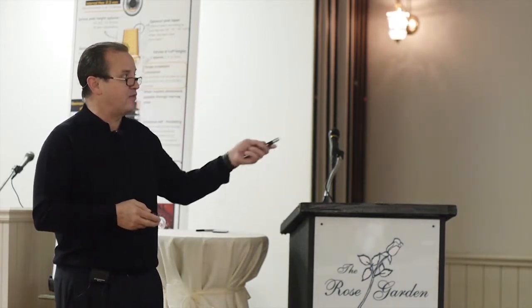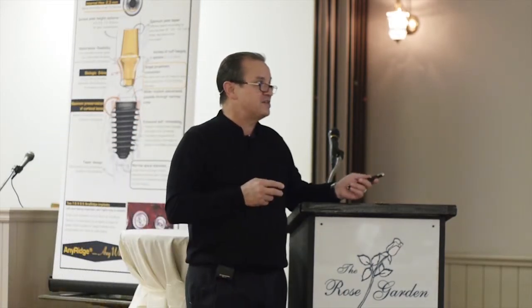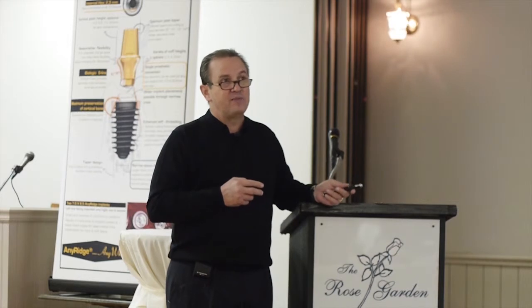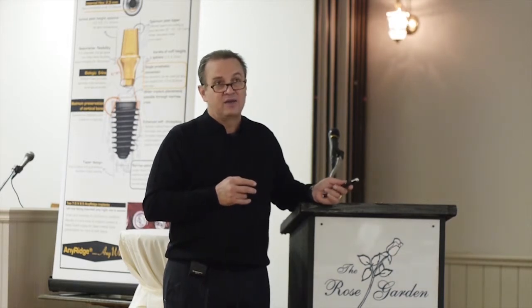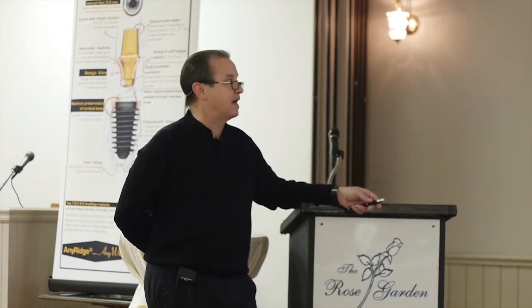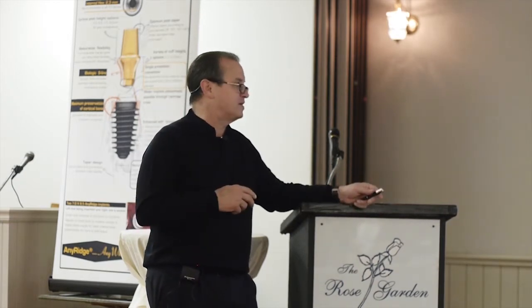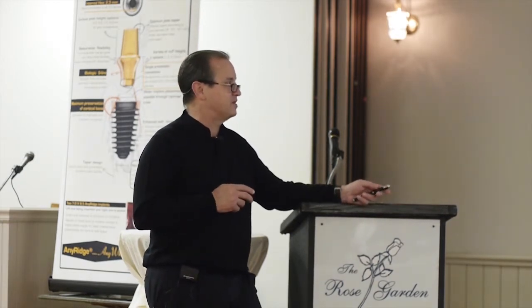Now that we've been doing this, I just don't use stock abutments anymore at all. I find this saves a lot of time. It's a little bit more expensive, not a lot. What does your stock abutment cost? $90. So these are $170. And then I have a temporary made for another $30 or something like that. And we can just take better impressions. I'll show you some more cases, and it'll become more apparent why I love these things so much.